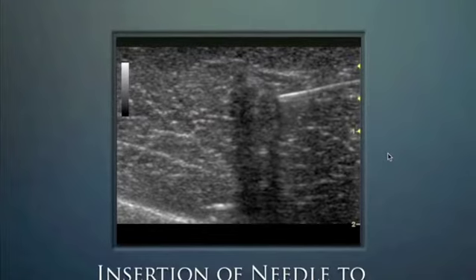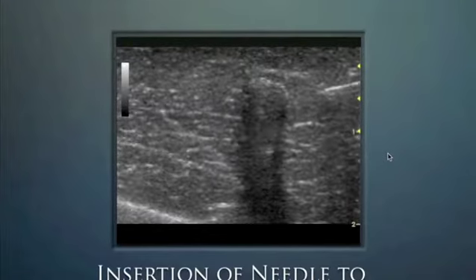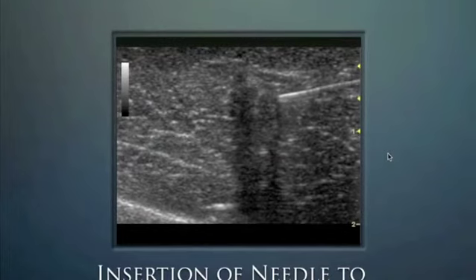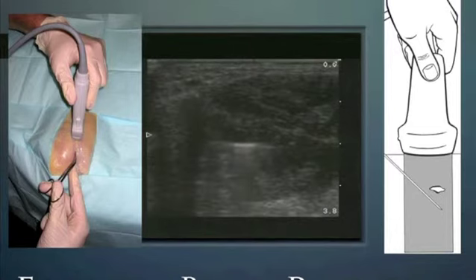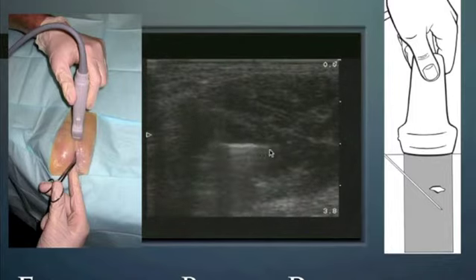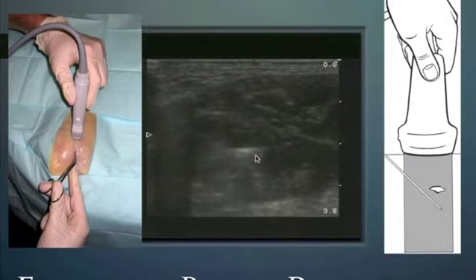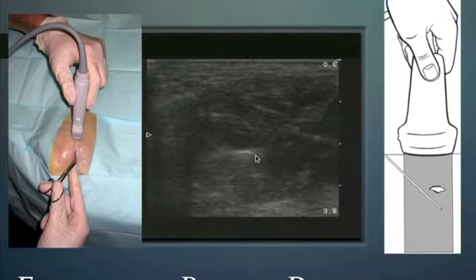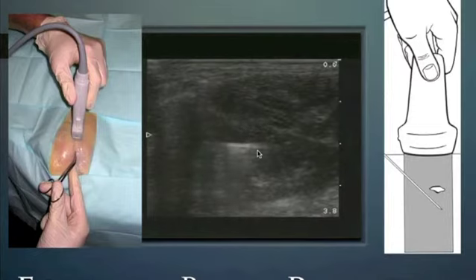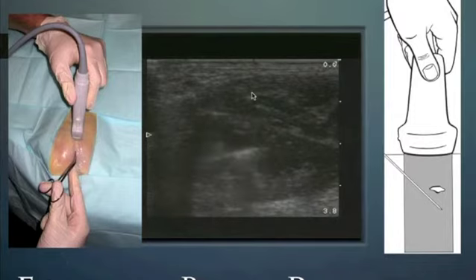This patient had a needle break off in their buttocks during an immunization years ago, and they came in because it was particularly discomforting on that particular day. When they arrived, we took a look with ultrasound and found this needle about 2 centimeters below the skin line. These are 1 centimeter hash marks.